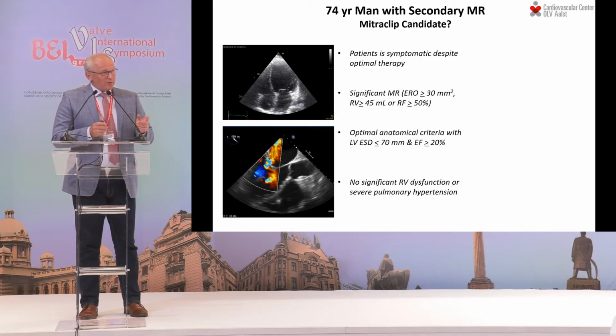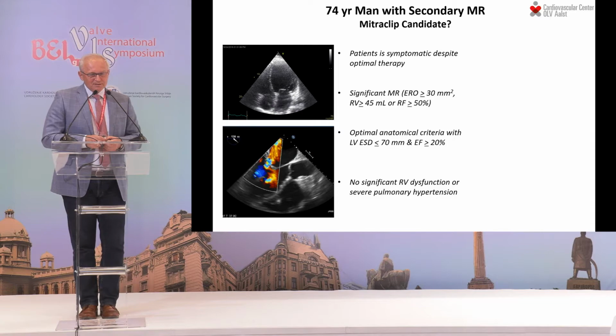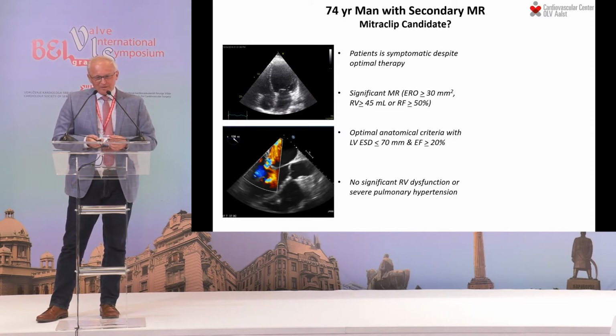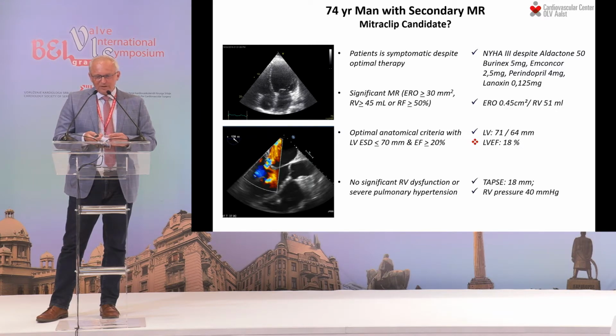So let's go back to the patients. So this was the story of the devices, evidence. Let's just see what we have done in these patients, basically to document how we could go around in practice with these 2 types of mitral insufficiency. So we have this patient, and you see his images. You see the criteria of the co-opt, and on the right side we are going to see now what his clinical features were.